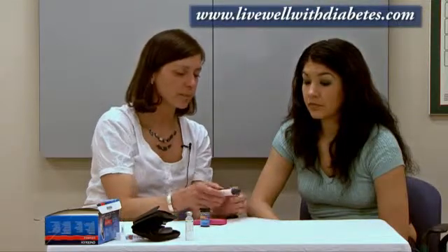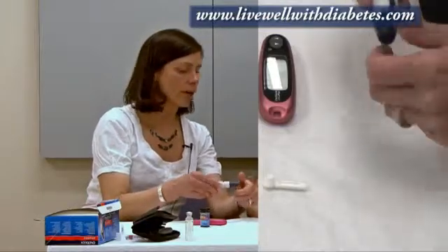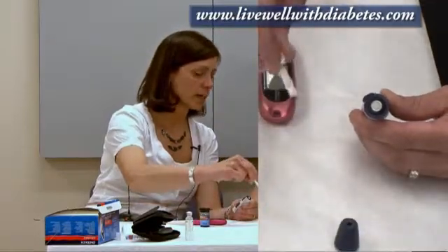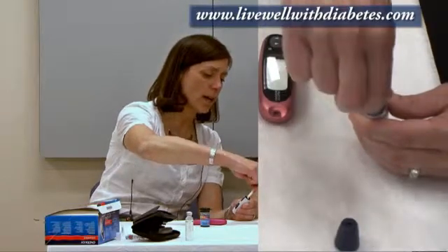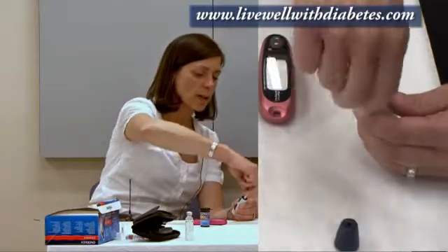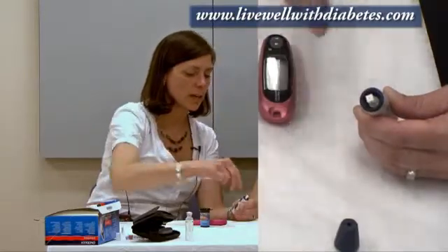First, I'm going to show you how to use this lancet device. This blue end is the cap — you first have to take it off. I pretend I've got a cracker and I'm just breaking it in half. I pull this off, and in this hole is where the lancet is going to fit. I pick up the lancet holding on to the round end, put the narrow end into this white area, and push it in firmly all the way down. Then I hold on to the round end, turn it until it loosens, and pull it off — and there's the needle.